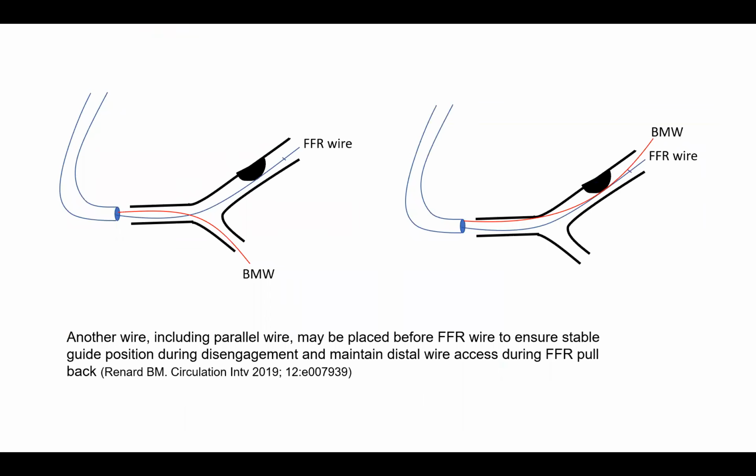Now, here is an important technical idea. There is a reason a lot of doctors don't like to disengage the guide, and they stick with wrong measurements of FFR and IFR, because we live in a radial era. Imagine how hard it is to disengage. When you disengage in a radial catheter, especially a radial guide, sometimes that guide will fly all the way out in the ascending aorta or subclavian if the patient takes a deep breath on top of it. And you may lose everything, including your FFR wire, and you have to restart over.